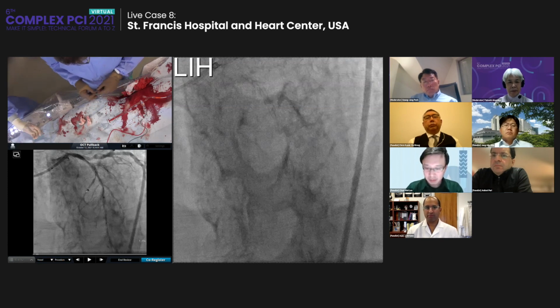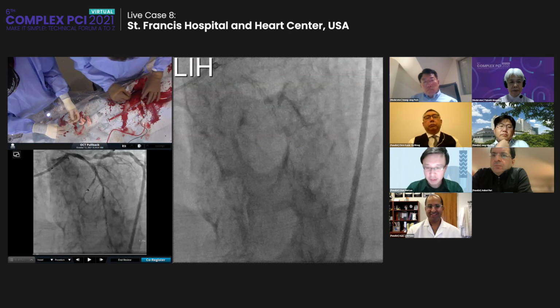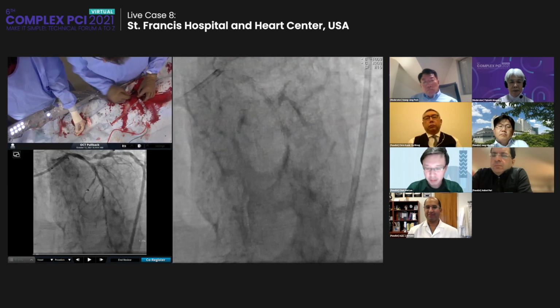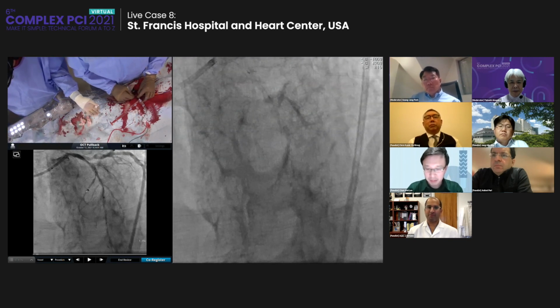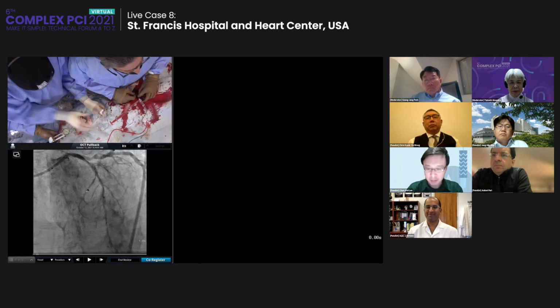I still have a nightmare about a case that was so heavily calcified that I did orbital atherectomy and I couldn't see the stent inside it. And I inadvertently did a stentectomy. We remember. You salvaged it well. Luckily, I didn't lose the wire. I didn't let the fellows do any more there. I'm like, I'm doing this.